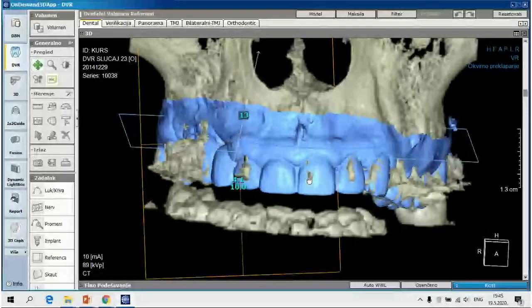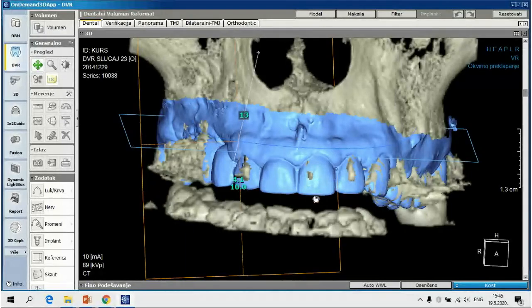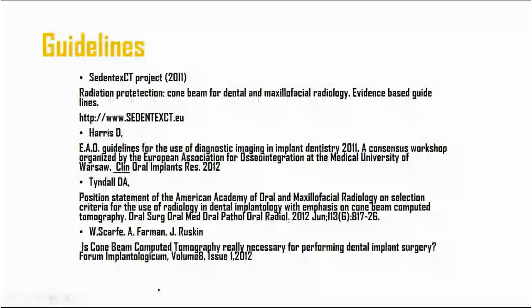We would just need a photograph of this patient with the smile, which will help us to combine this procedure to the end. We will go back to the procedure.